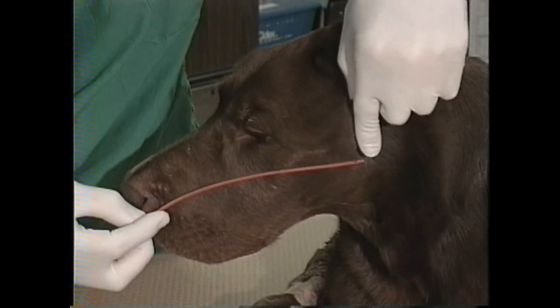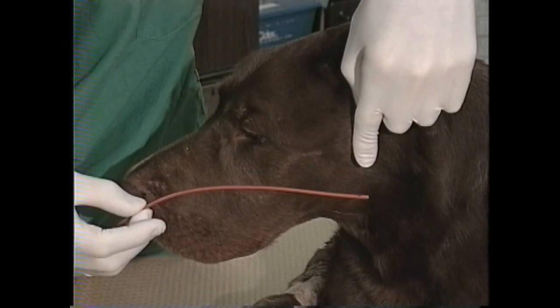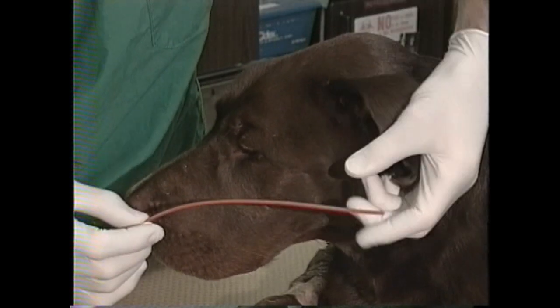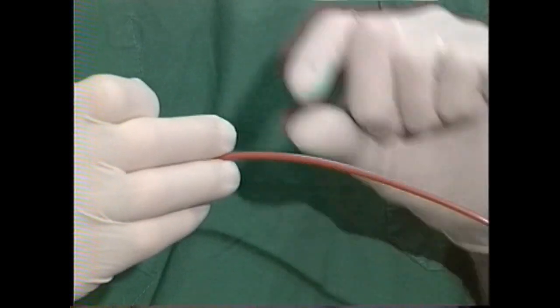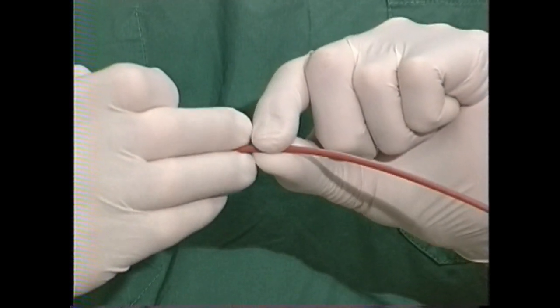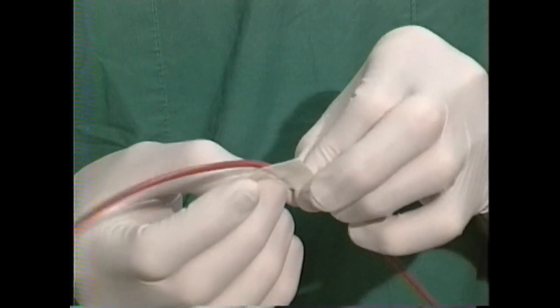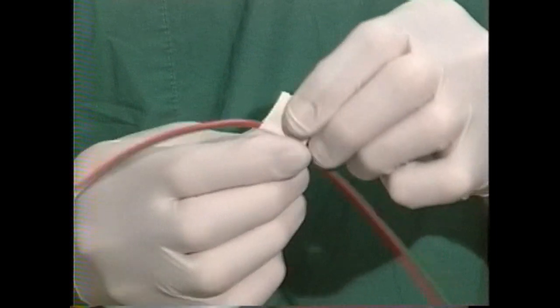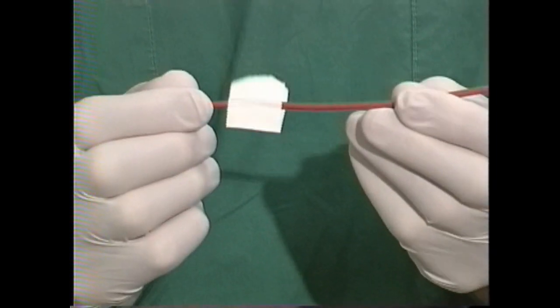Now I'll determine the depth of placement of the catheter. The anatomical landmark is the vertical ramus of the mandible. This will put the tip of the catheter over the soft palate and the nasopharynx. I'll mark that location on the tube by keeping my fingers at the depth of the orifice of the nostril and putting a little pledge of waterproof white tape in a butterfly wing pattern around the catheter — that will serve as both a depth gauge and material to suture to in order to secure it.